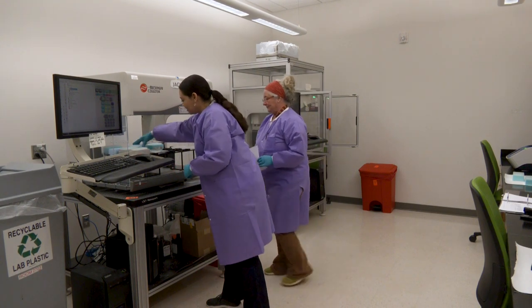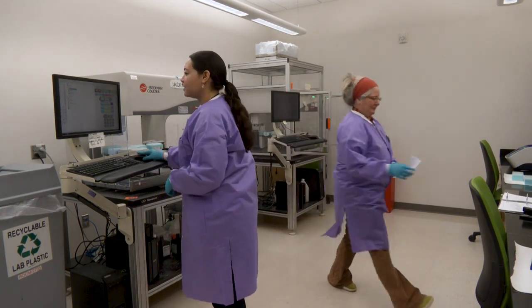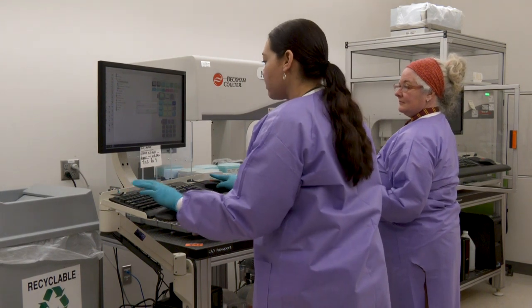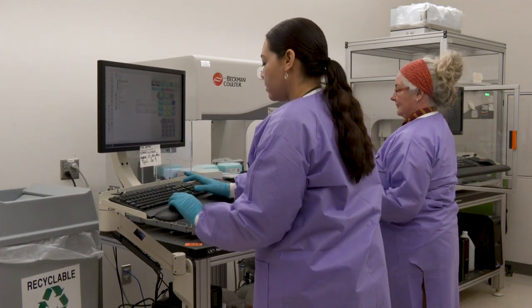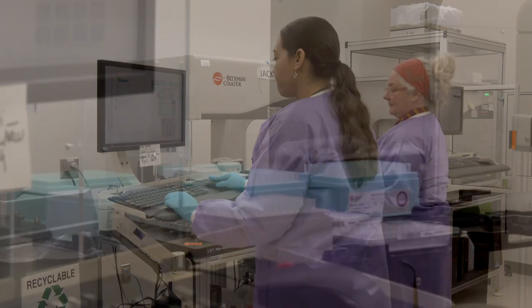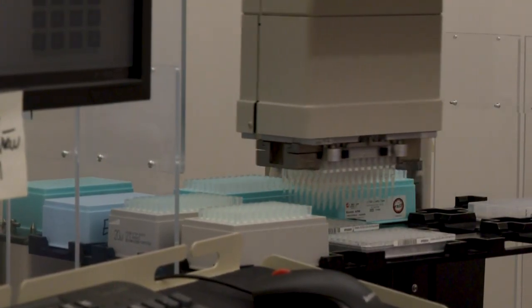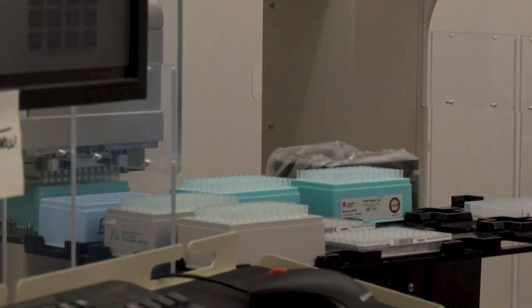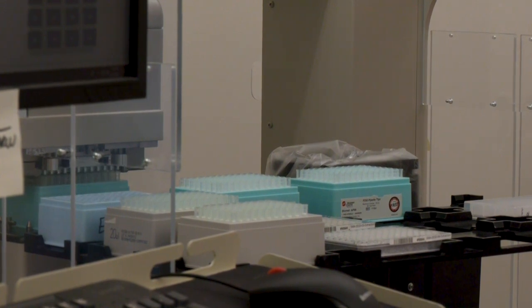The newborn screening molecular laboratory identifies babies at increased risk for SCID, which stands for Severe Combined Immunodeficiency, and SMA, also known as spinal muscular atrophy, using a technology called real-time PCR to test the baby's DNA. SCID is a condition that impacts the immune system. Individuals with SCID have a very weak immune system. As a result, infections that are minor to most people can be life-threatening to individuals with SCID. SMA, on the other hand, is a disorder that affects cells in the nervous system and can impact the baby's ability to crawl, walk, or breathe.